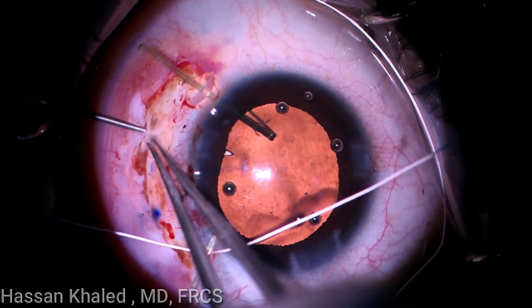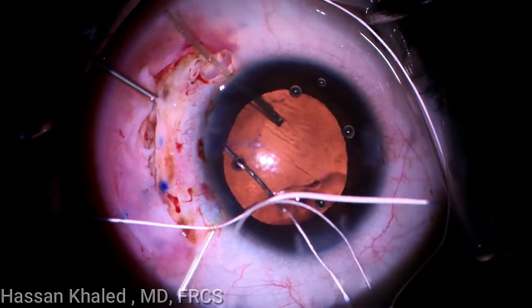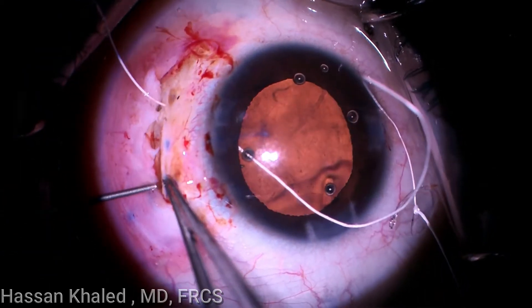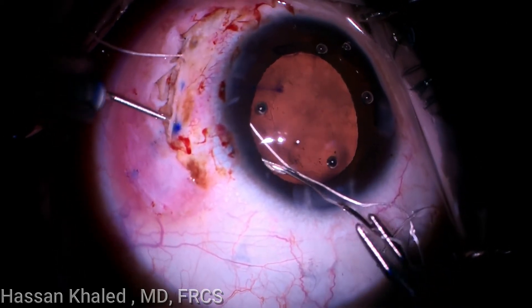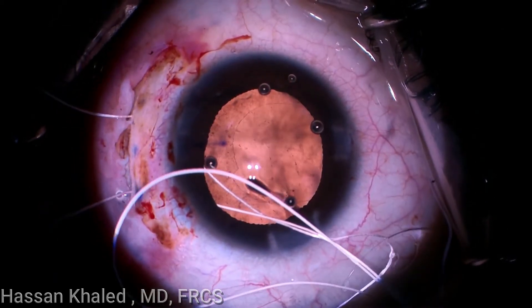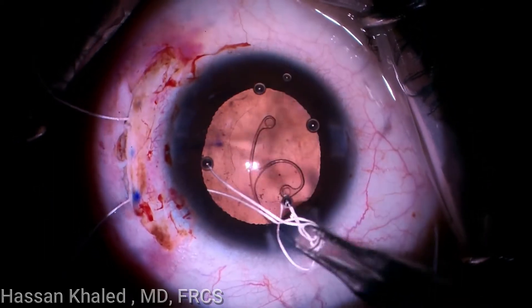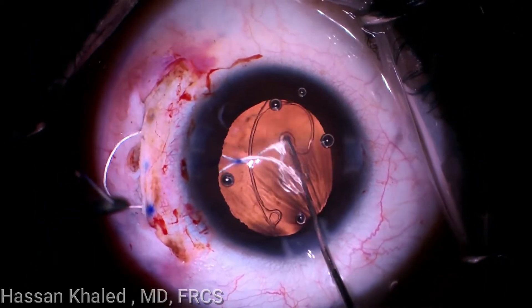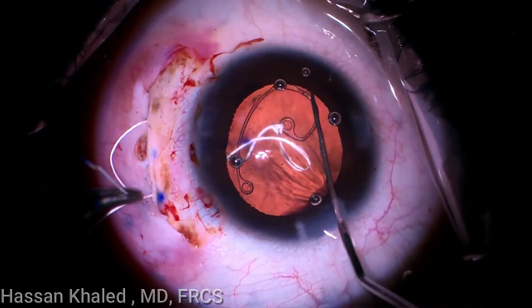A 27-gauge insulin needle is passed 2 mm behind the limbus through the scleral pocket, underneath the iris and anterior capsule. Then the first arm of the suture is docked through the 27-gauge needle and exteriorized, as you can see. The same process is done with the second suture needle.